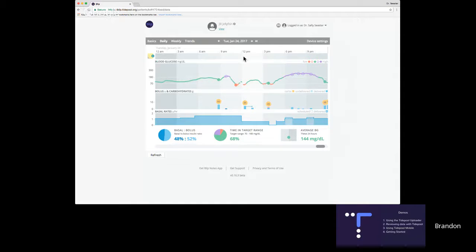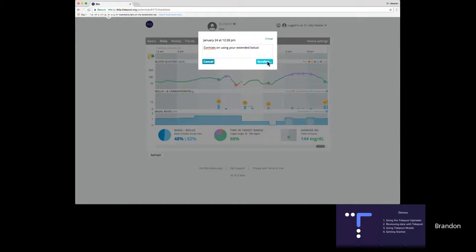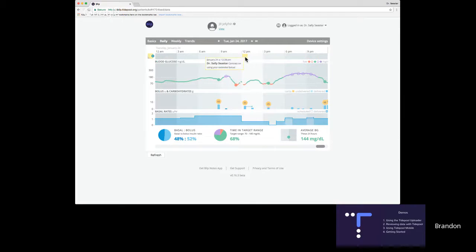There's one other thing I wanted to show you — you can go ahead and add a note for Jill. For instance, you might want to congratulate Jill on using her extended bolus feature. That note now shows up in Tidepool and she can see it later, or you can see it together the next time she's in for a clinic visit.